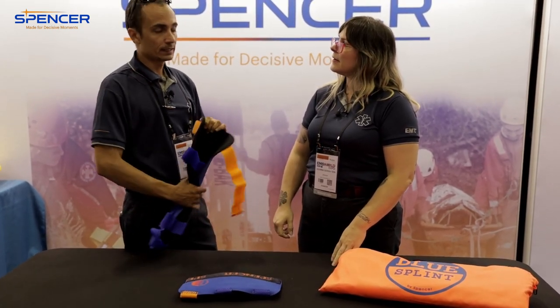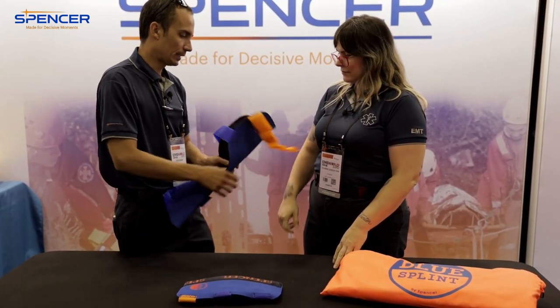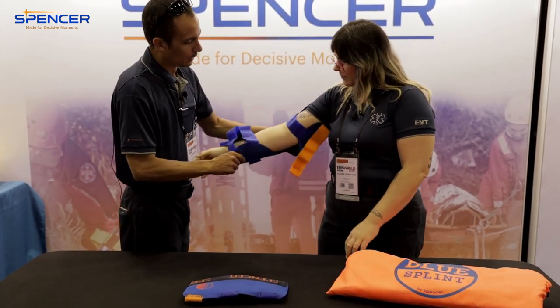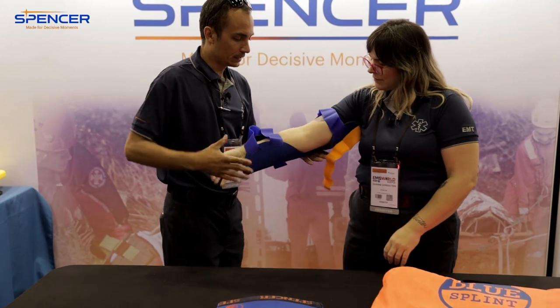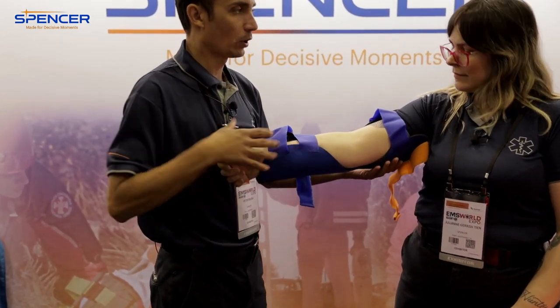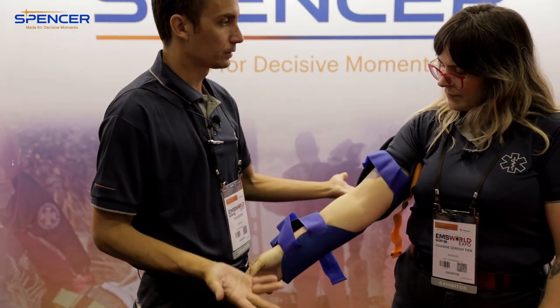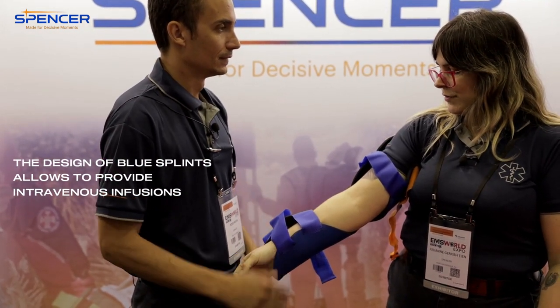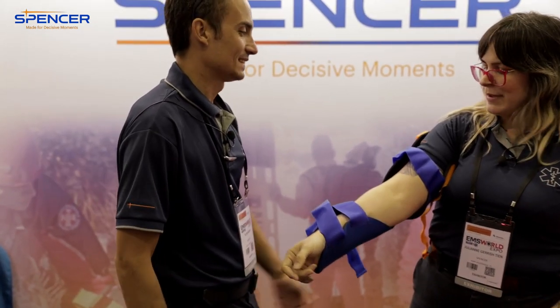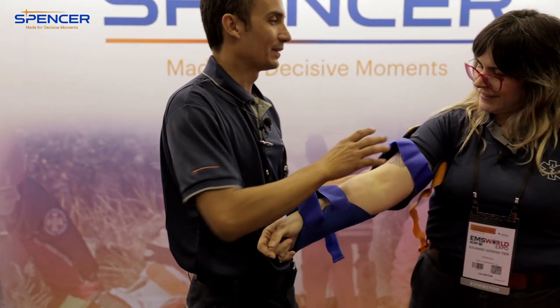One thing we learned — when you have somebody on the stretcher and you give them an IV, they like to bend their arm. But this is super comfortable; you just put this on and it keeps their arm straight and keeps your IV flowing. I hate when people kink up their IV and the medicine stops going — then it looks like you didn't do anything when you got to the hospital.